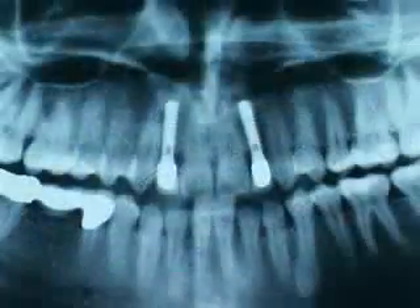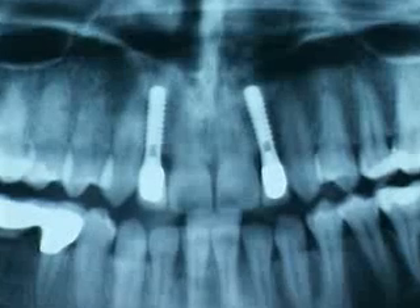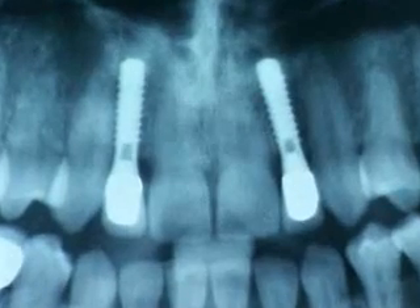On the X-ray film, we can see that the narrow neck Standard Plus implants are excellently integrated into the bone structure and that their profile ideally matches the marginal anatomy.